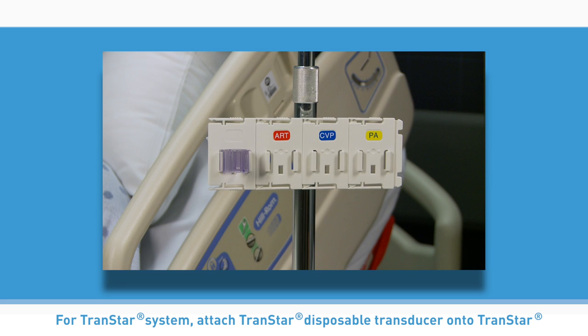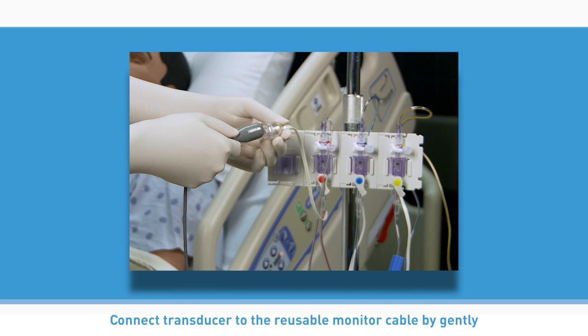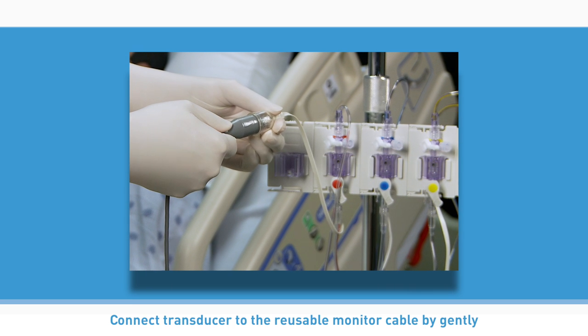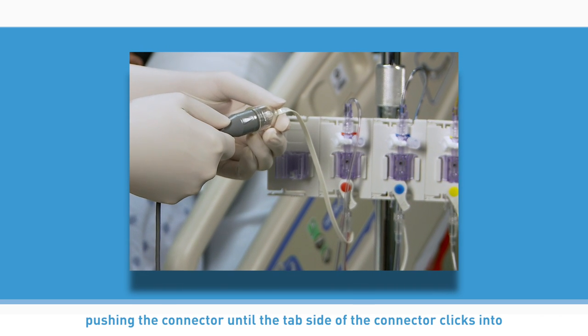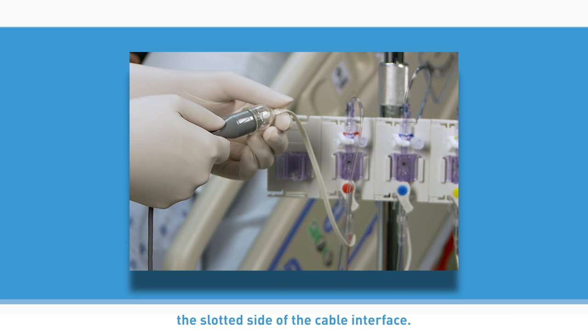For the Transtar system, attach the Transtar disposable transducer onto the Transtar mounting system. Connect the transducer to the reusable monitor cable by gently pushing the connector until the tab side of the connector clicks into the slotted side of the cable interface.